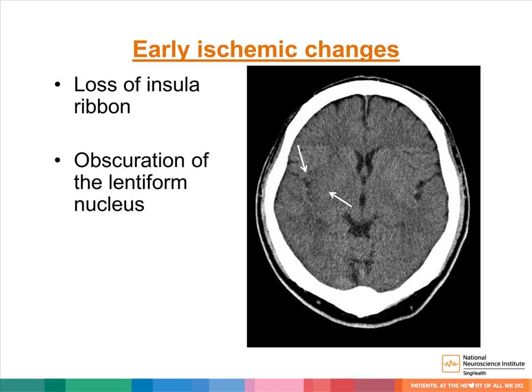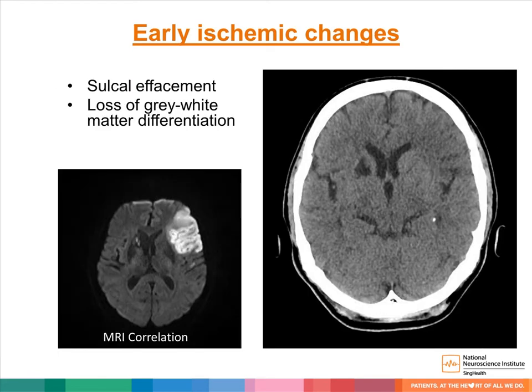In this example of an acute ischemic stroke, there is loss of the right insular ribbon and obscuration of the right lentiform nucleus, compatible with a right middle cerebral artery territory infarct. In this example, we see loss of grey-white matter differentiation and swelling in the left frontal lobe compatible with an acute left middle cerebral artery territory infarct.